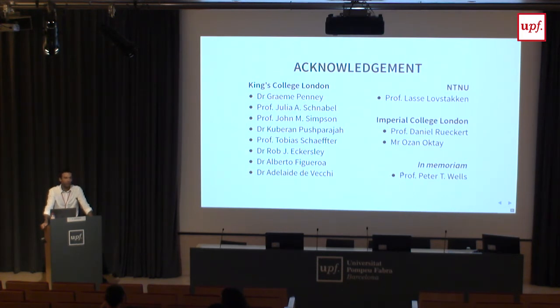So we have some work done earlier this year where we tried to do this just for anatomical comparison, not for flow. And after using lots of methods that are available there, we found out that the most reliable way of aligning ultrasound and MRI is manually. So just by picking landmarks with a clinician. And that just works so good, or the other methods work so badly, except for a few cases that people use to publish papers.